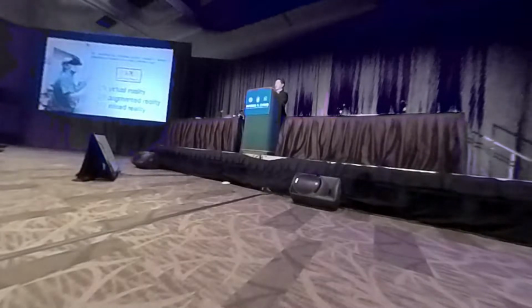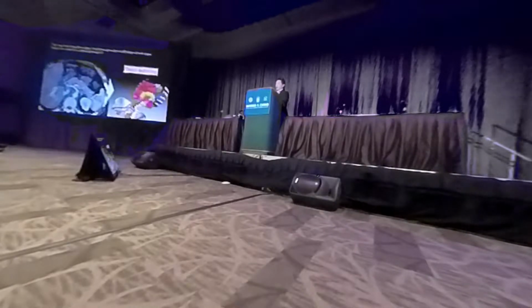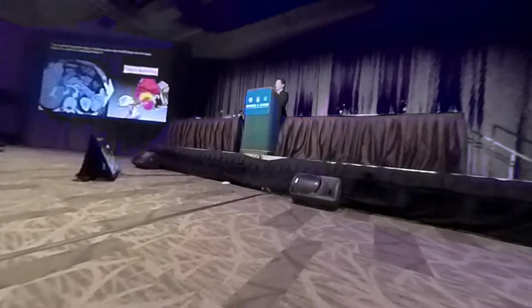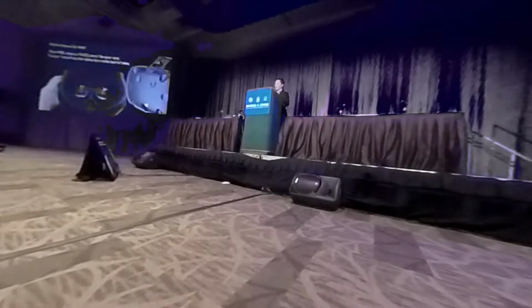So we developed an integrated surgical navigation system of patient-based immersive extended reality for surgery. Extended reality contains VR, AR, and MR. First, you need to extract 3D surface polygon models for each organ out of the patient's CT or MRI. The deep learning system using cloud AI reconstructs the 3D shape of each organ, tumor, and vessels from the patient's individual CT. And we usually use this full HD stereo 3D head-mount display.